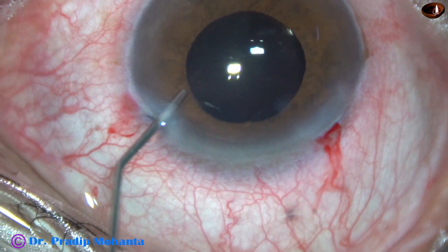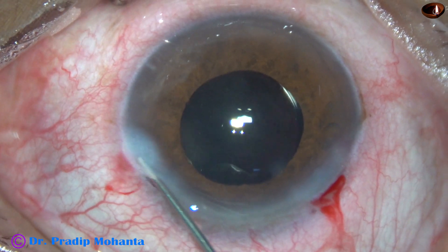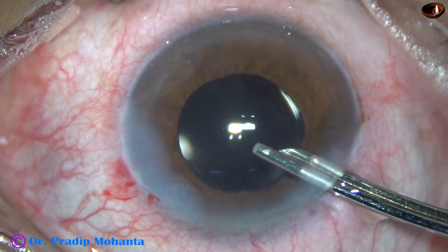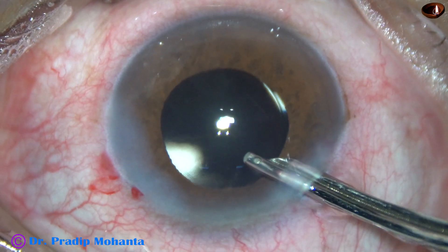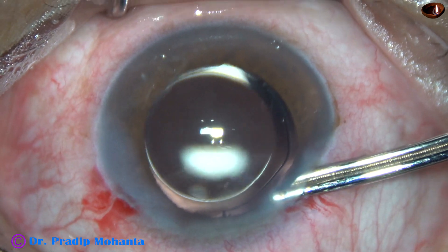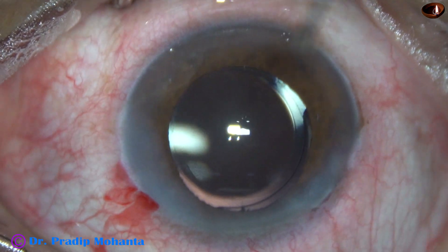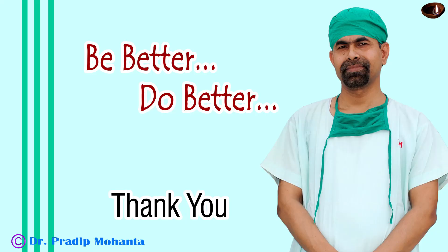Now this is moxifloxacin injection. The sideport is closed by hydrating the corneal stroma on either side of the paracentesis wound. This is the final lavage of the anterior chamber. The anterior chamber is formed nicely. In this case, we have observed how to use the lens-iris diaphragm retropulsion syndrome technique to combat IFIS — that is, intraoperative floppy iris syndrome. Thank you very much for watching. Hope this video will help you in your practice.